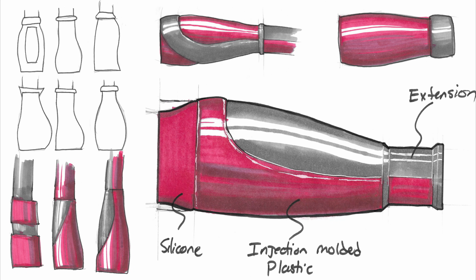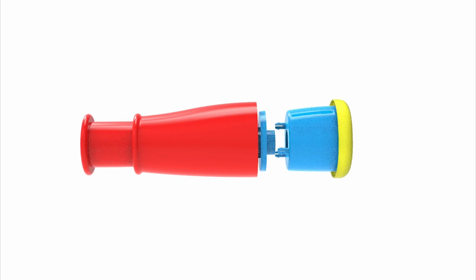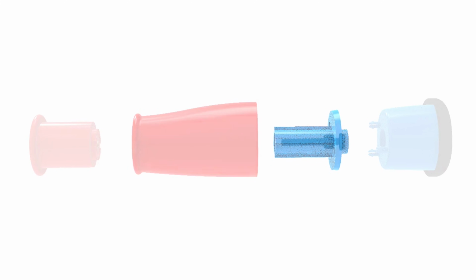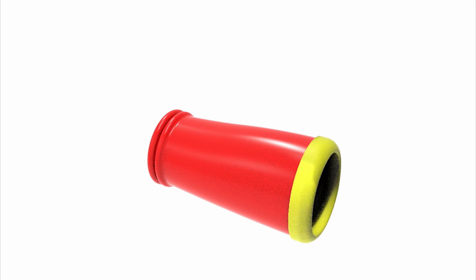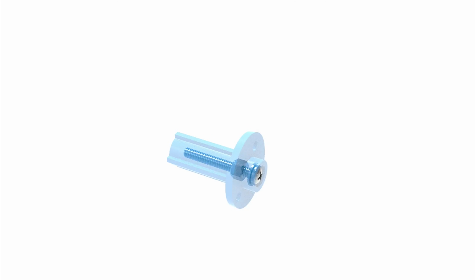After developing the internal components of the forearm, we looked at possible forms that this would be and finalized the forearm as a whole. Overall, the forearm is made up of 4 components: the wrist extension, the shell, the extension insert, and the socket insert. The wrist extension moves by a threaded insert embedded inside. The threaded insert is attached to the extension insert.